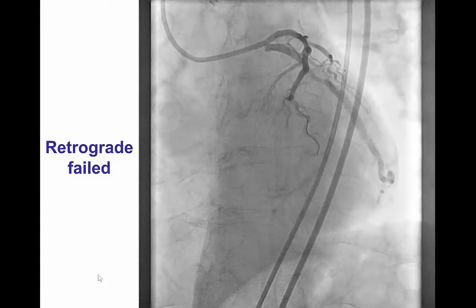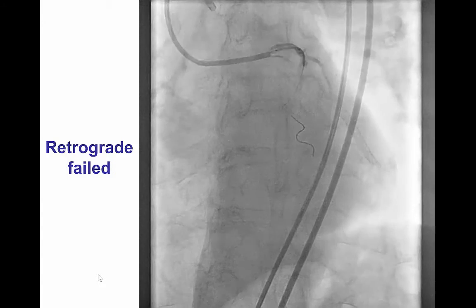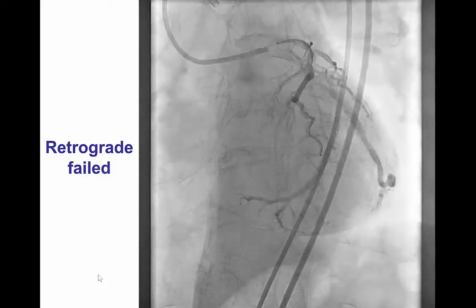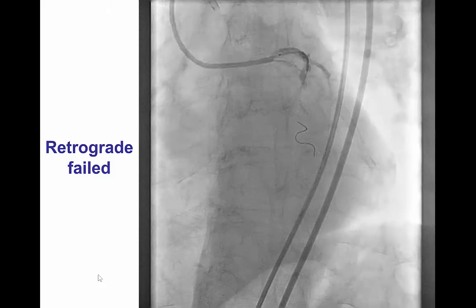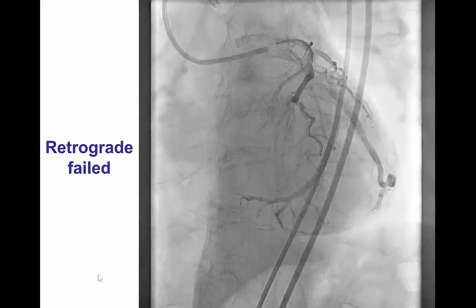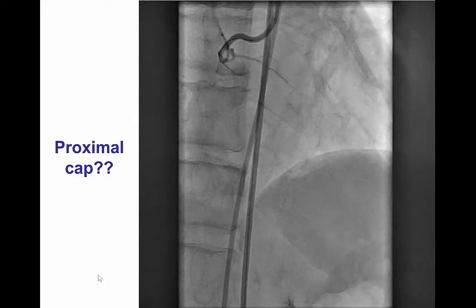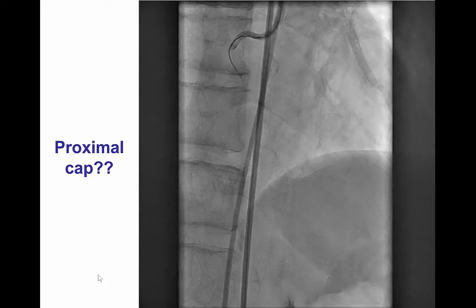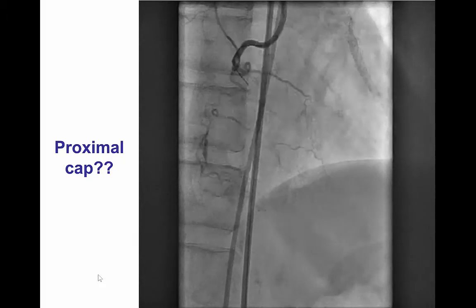Given the long length of occlusion, the ambiguous proximal cap, and the presence of good collaterals, the first attempt was a primary retrograde approach. However, despite several attempts to wire through the septal collateral, we were unable to do so, and as a result we switched back to an antegrade approach. We did multiple angiographic projections in an attempt to clarify the ambiguity of the proximal cap.